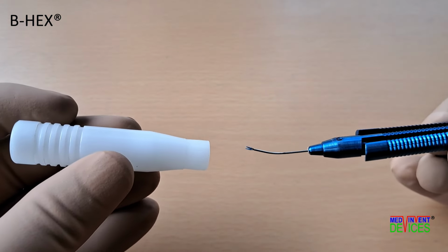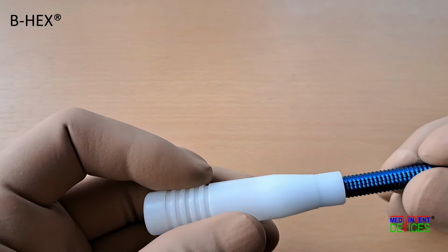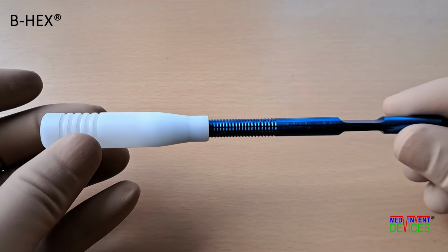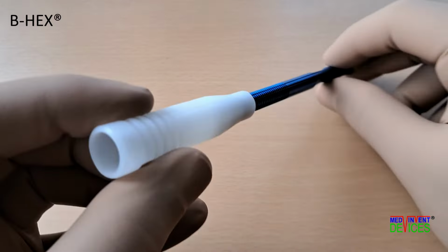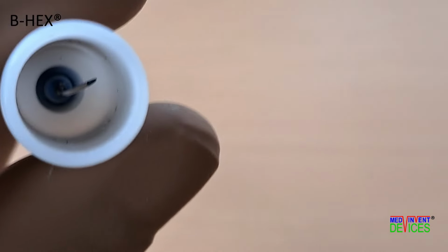First, the jaws are closed by squeezing the handle. Then, the narrow end of the plastic cap is slid over the closed jaws and stalk. The narrow end of the cap must be slid all the way to cover the squeeze arms of the handle, till it stops. This ensures that the jaws remain closed even after the squeeze arms are released.